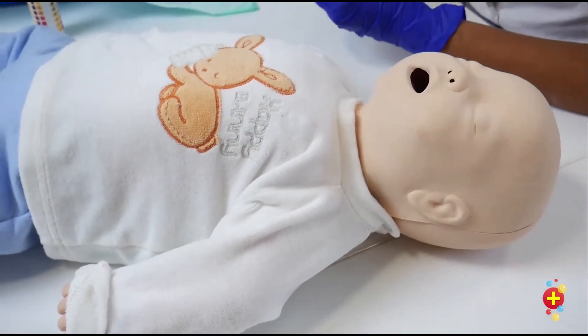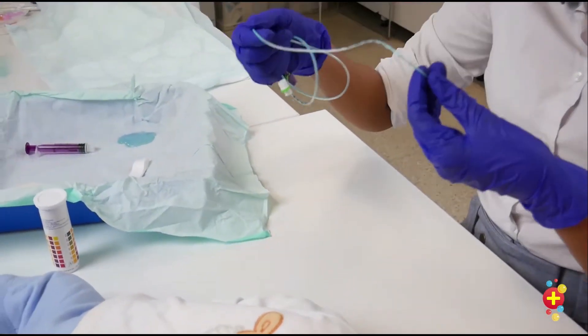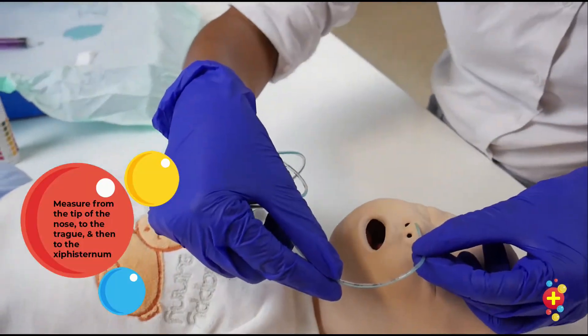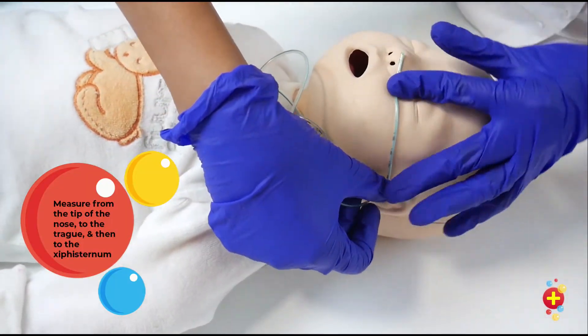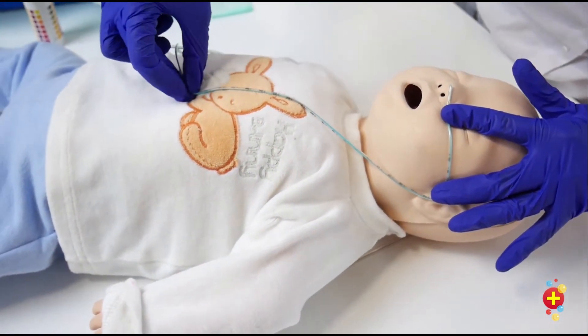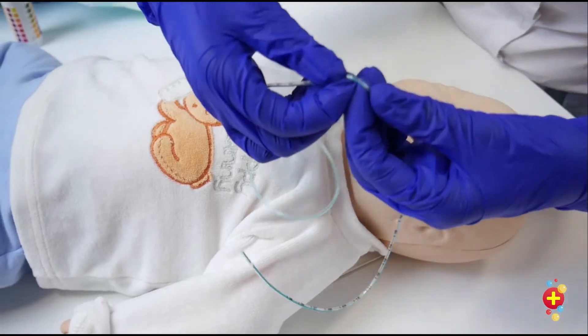The most important thing is to pick the right size and measure the tube prior to insertion. We have a size 5 French for this small infant, and we measure from the tip of the nose to the tragus, down to the xiphisternum. Then note the measurement on the tube.